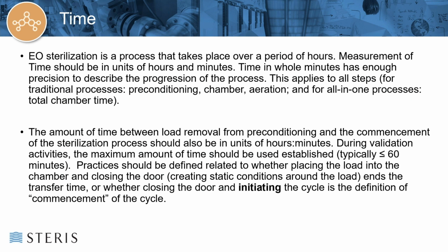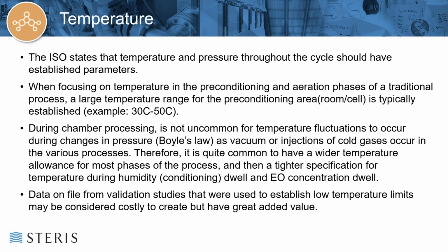So another consideration you want to take is the amount of time between load removal from preconditioning and the commencement of the sterilization process. It should also be in hours and minutes. And during the validation, you're going to establish that time to show that the load will still continue to retain the temperature and humidity that it needs in order to process easily and within the boundaries of your validation. Your practices should be defined as to whether placing the load inside the chamber and then closing the door is considered initiation of the cycle, or if it actually means pushing the start button. You want to document what your practices are so that there's no question for regulatory authorities that come in.